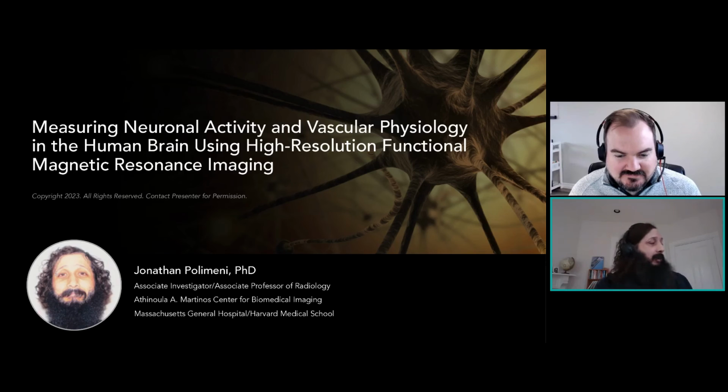It depends on the patient population. I think that there are new tools for online QA/QC of the data, so that if you have a patient population, you're running a 6-minute scan, and there's some movement during the scan, the techs can be alerted immediately. You can give the patient a pep talk and repeat the scan. So I think that these online QA/QC tools are really valuable so that not only can one repeat if needed, but one knows when enough data have been acquired. I think that it really depends, however, on the paradigm. For example, one can see the default network in resting state fMRI in about 10 minutes of scanning, and sometimes even less.